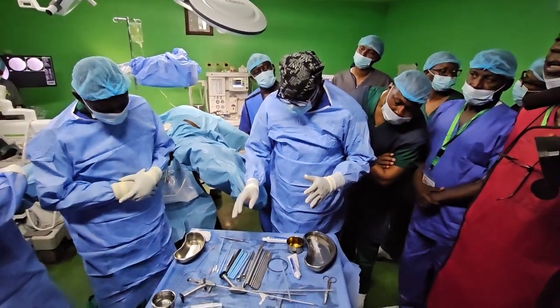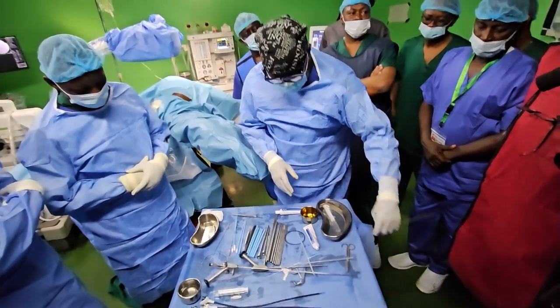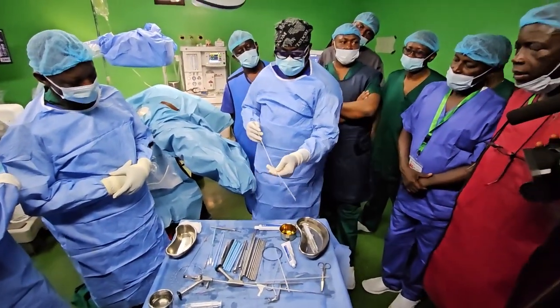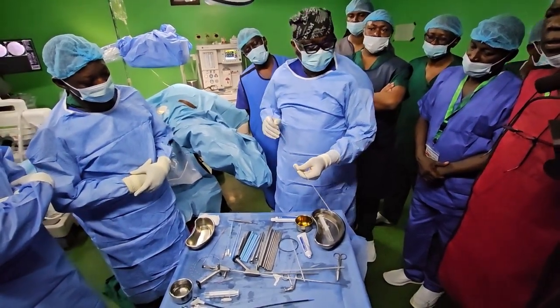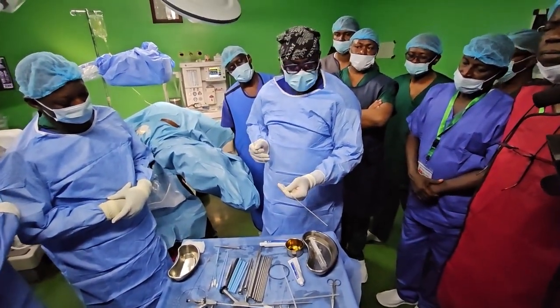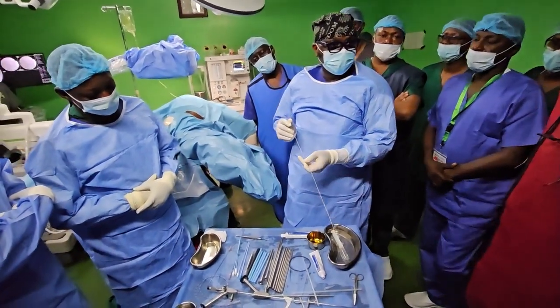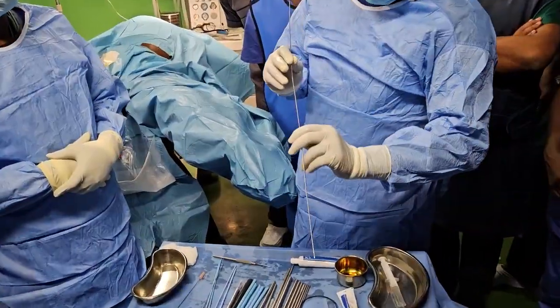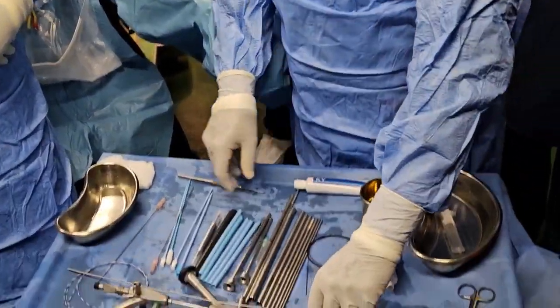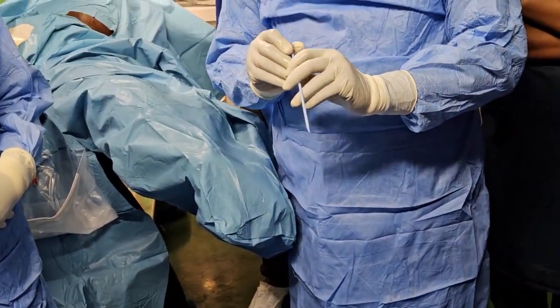So now, in my practice, I use Alken's dilatation system. I use the Alken dilatation set. This is the rod. Once I get a good puncture, the first thing I do is I dilate with this. This is very easy.